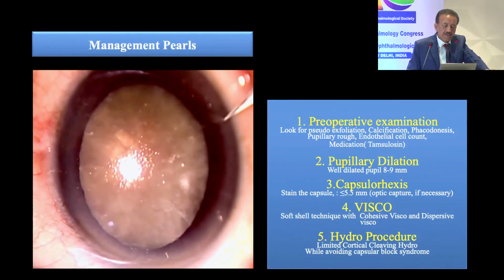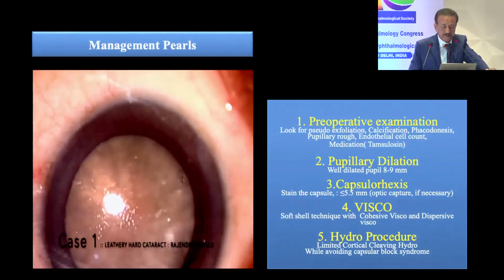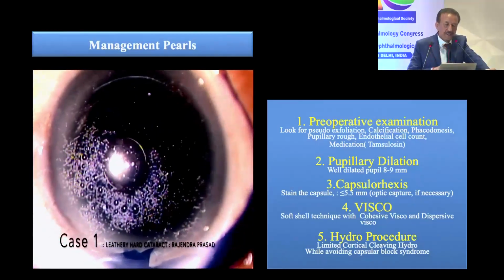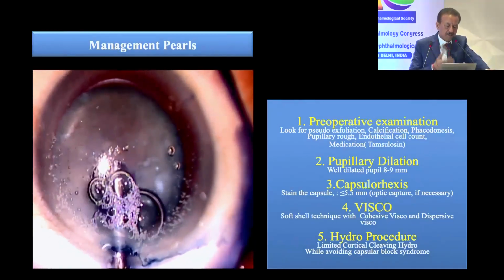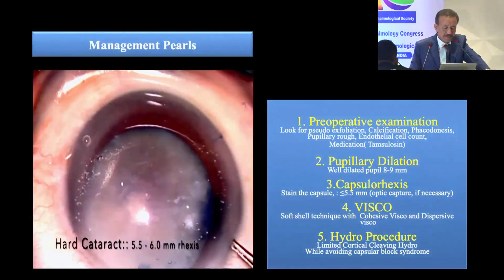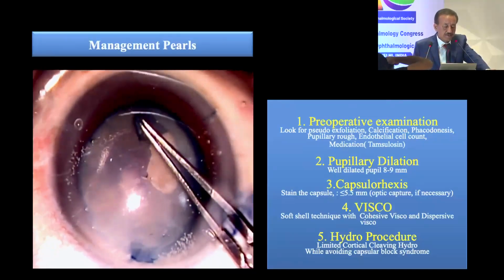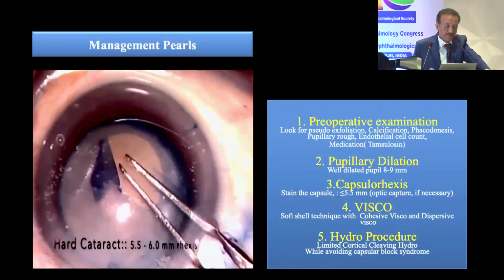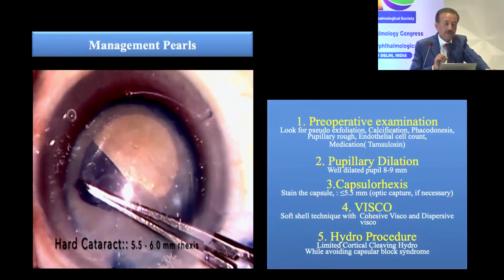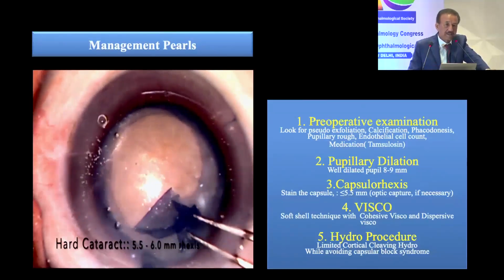Your pre-operative examination is very important because you should know what case you are dealing with in your OT. You need to look at the capsular status, pseudoexfoliation, the hardness of the nucleus, and the dilation of the pupil. You must have a very large dilated pupil, and during the surgery you must stain the capsule so that you get a large capsulorhexis, always aiming for at least 5.5 to 6 millimeters in these cases, not less than that, if you have to manipulate these hard nuclei.